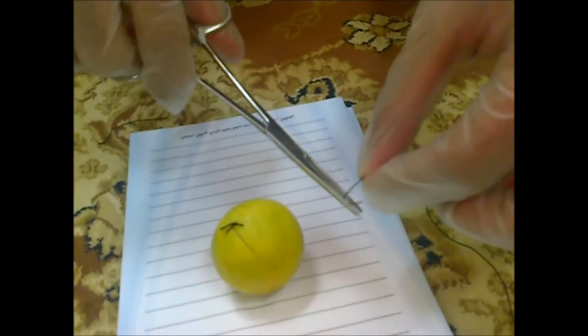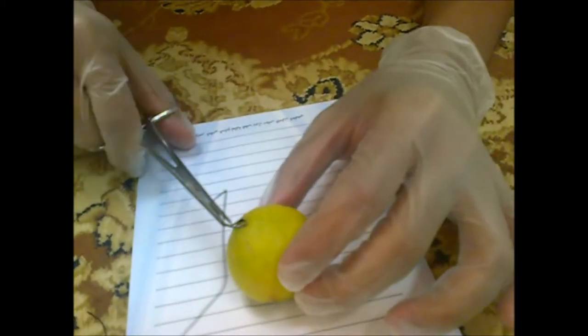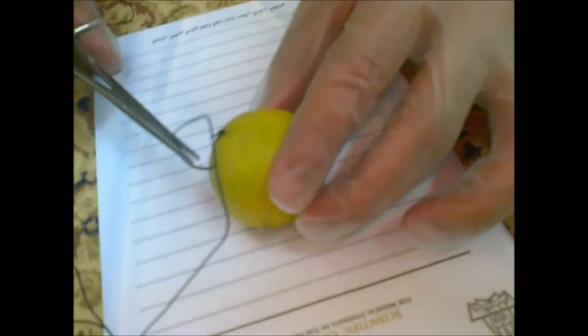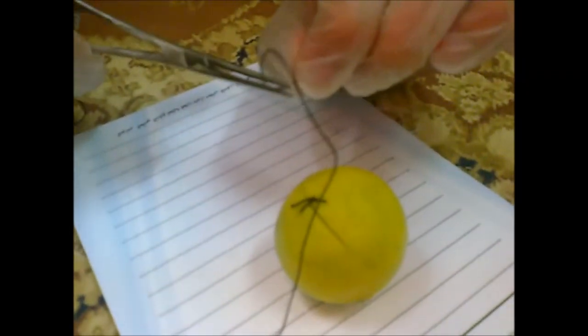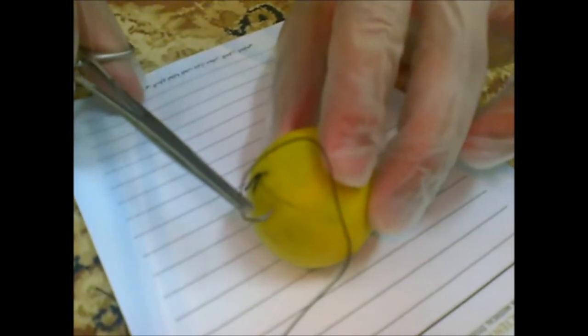We need to do more. Insert the needle. You can do it like this. We are learning. In the skin, in the skin.